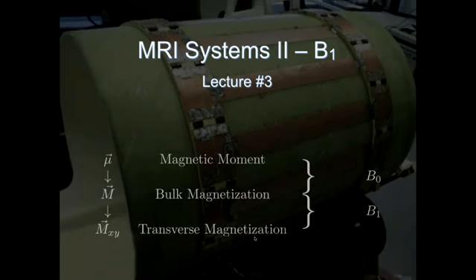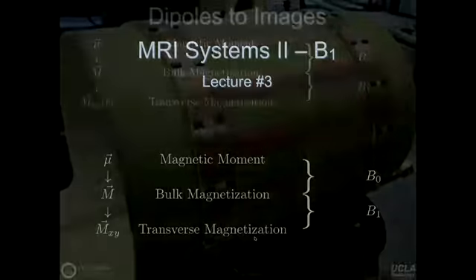There's a lot of interplay. We'll get into this when we start talking more about pulse sequences. A lot of interplay between the longitudinal and transverse magnetization that's central to image contrast, for example. But it's important to remember that we're only sensitive to detecting or measuring information that's stored in the so-called transverse magnetization. And we'll talk about that a bit today as well.